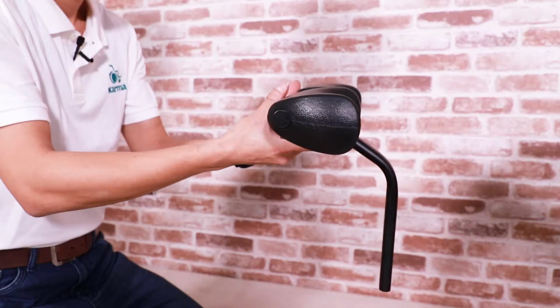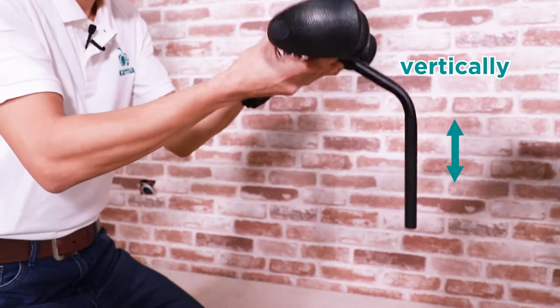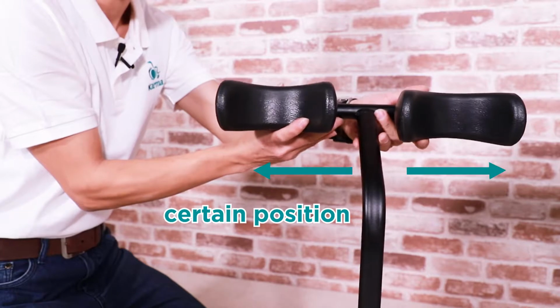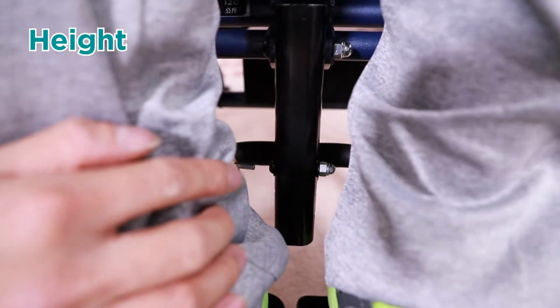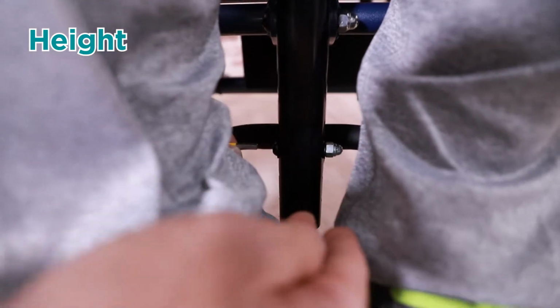The knee support can be adjusted in 4 directions and positions. It can be adjusted vertically and horizontally. The pads themselves can also be adjusted in position and angle. The height of this knee support can be set by these nuts and bolts. We can find them at the base of the knee support frame.